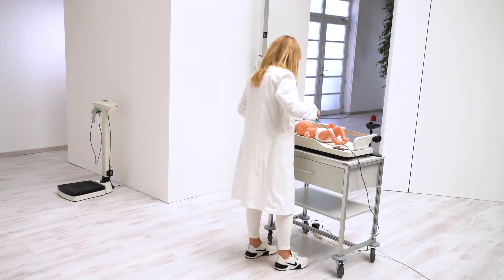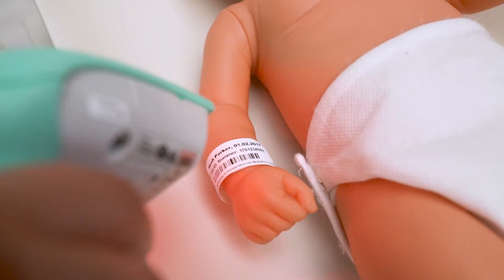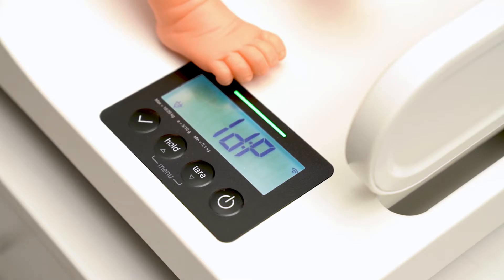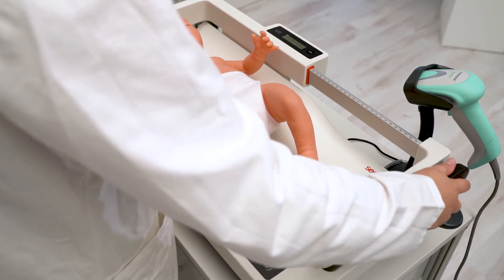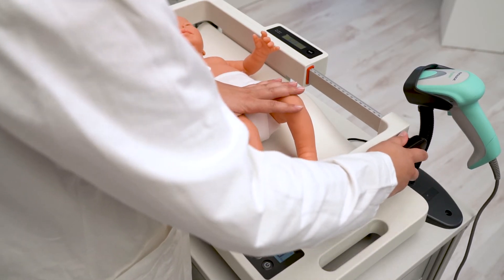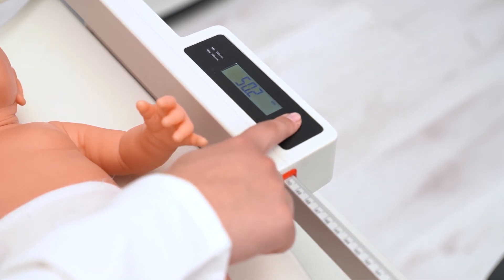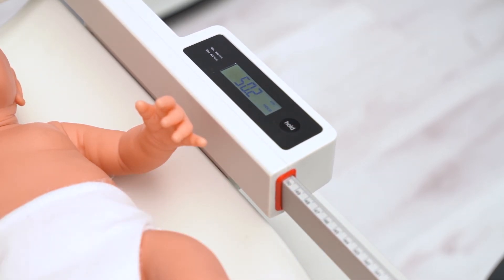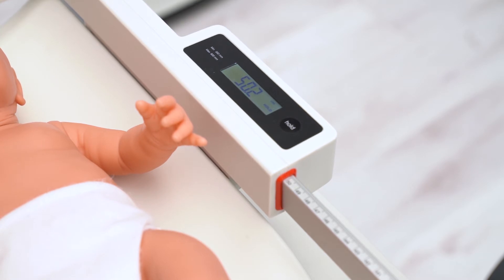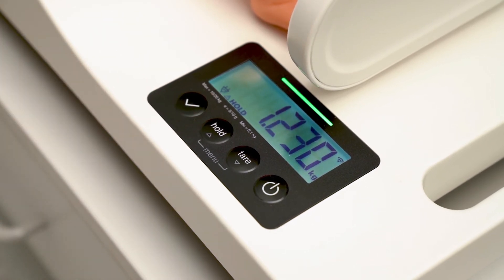Now, the ID of the baby is determined, ideally also by a scan of a barcode on the baby's record or a wristband. The display of the measuring station will show this code. Always securing the baby with at least one hand, the user moves the measuring rod to determine the length of the baby. Once the length is determined, pushing the hold key will save the length measurement, which is confirmed by an audible signal. The user then confirms the measurements by pressing the button with the check mark.